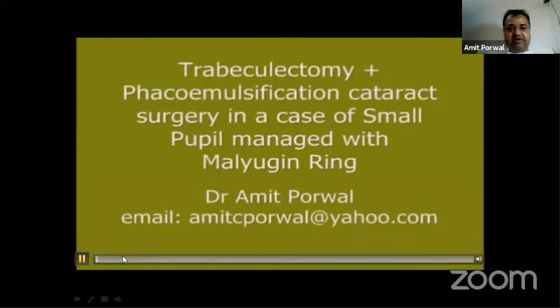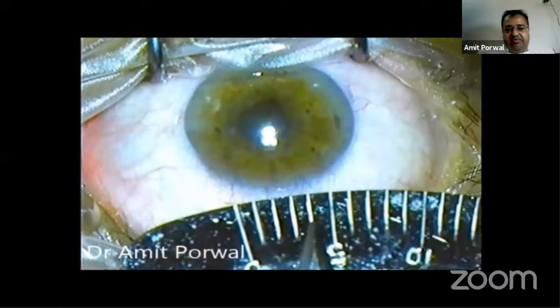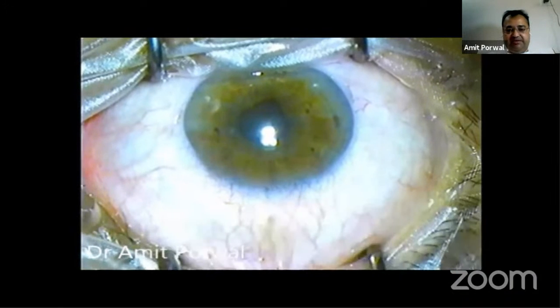So this was a case of trabeculectomy with phacoemulsification in a case of small pupil, and this small pupil was addressed using a Malyugin ring pupil expansion device.